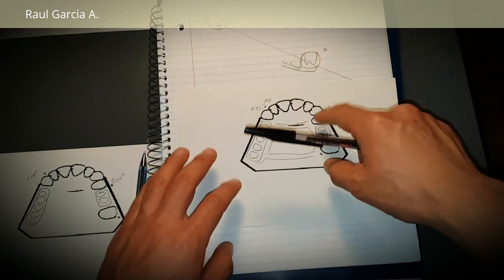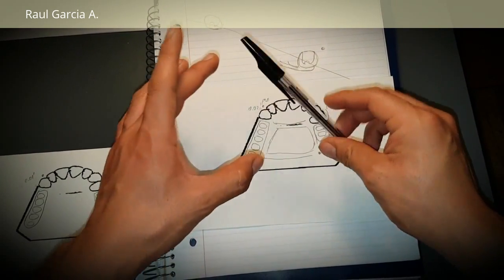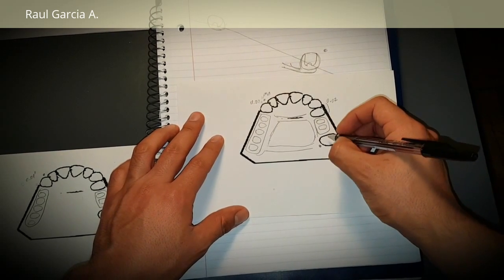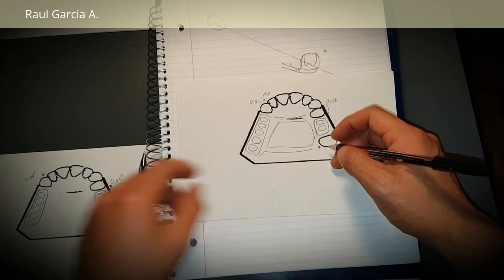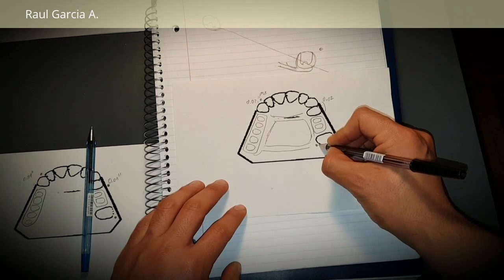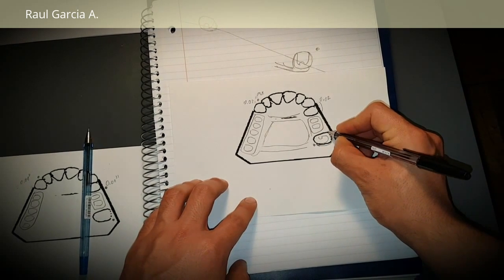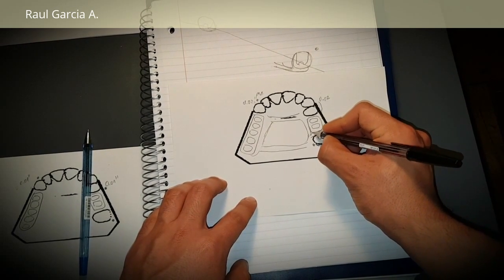Remember, first you have to design your fulcrum. So you have to decide where you're going to put your rests. So in here, I'm going to show you this. Let's say, which clasp can we use which engages the distal lingual or distal palatal? Always start there. And you can go with a back action. Perfect. Occlusal rest, go there. Always you have your guiding plane, and it follows and joins the structure there.